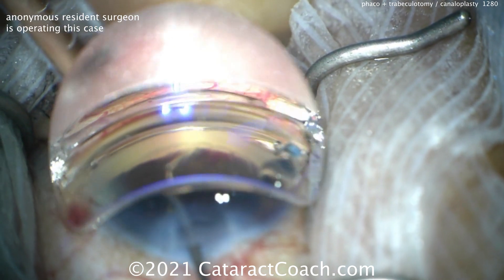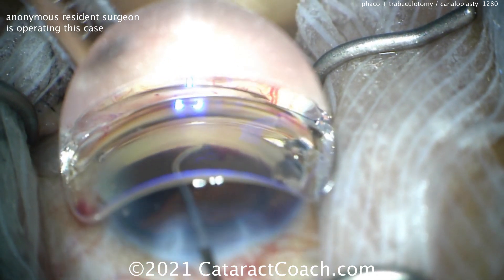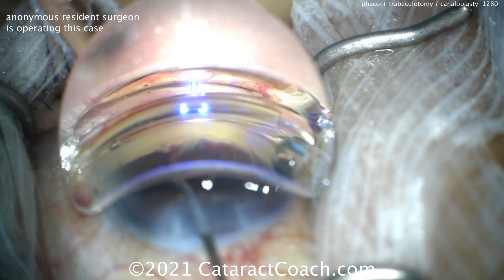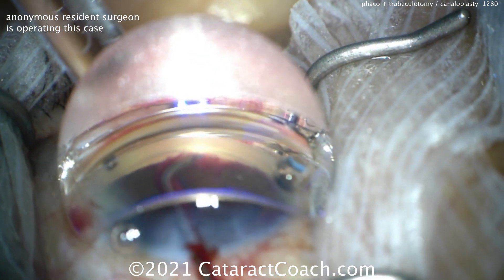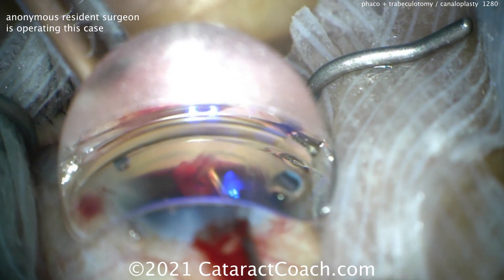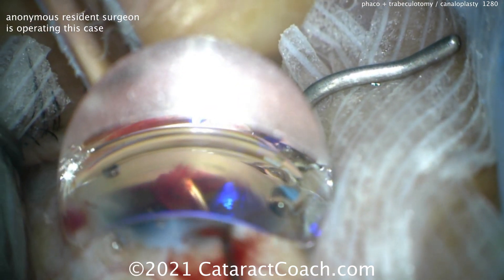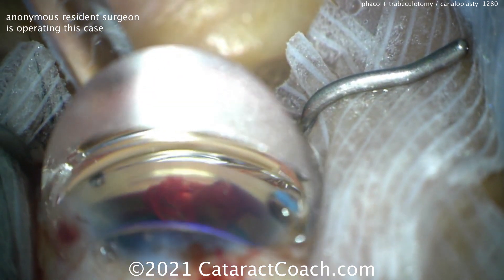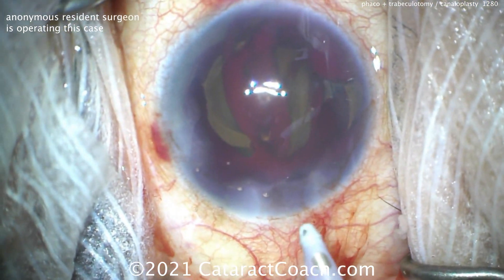See the view gets lost a little bit? That's because the AC is shallowing and we're distorting the cornea a little bit, so be careful of that. Now once you advance this all the way on this side, we're going to do something a little different — you're going to actually pull it out to unroof that area, and you're basically doing a trabeculotomy. Taking all that area out — that looks great. Now there is bleeding. Is that okay? Yes, that is okay to have the bleeding.